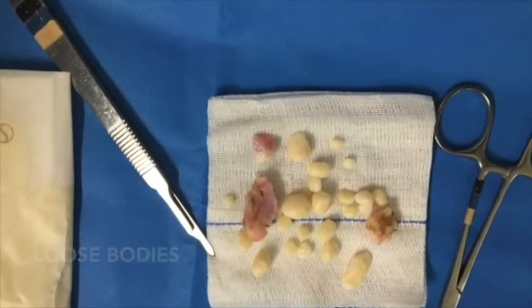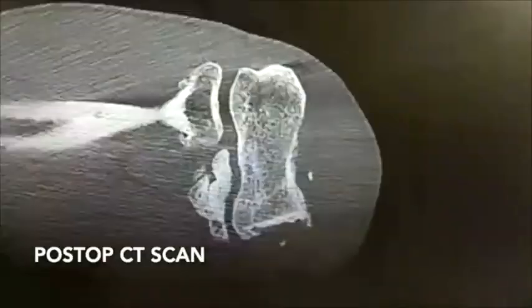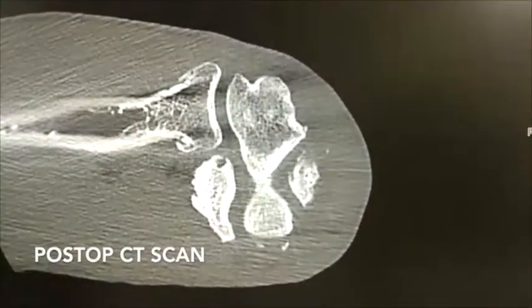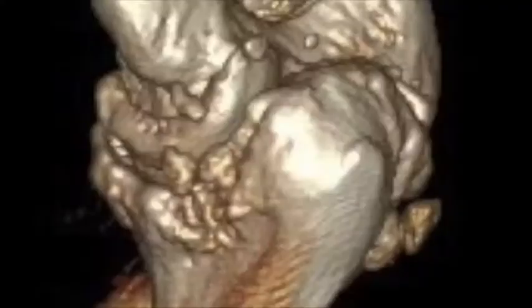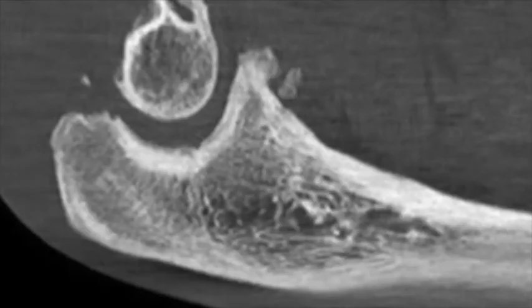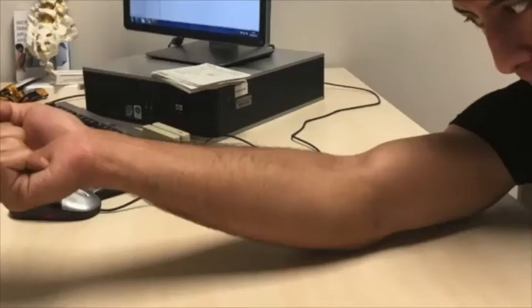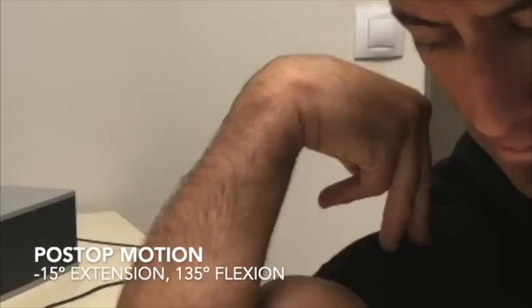These are the loose bodies extracted during surgery, and these are the post-operative X-ray and CT scan. We can confirm that a significant amount of bone and osteophytes were removed from the olecranon fossa and the coronoid fossa, and the patient significantly improved his elbow mobility after this arthroscopic surgery.